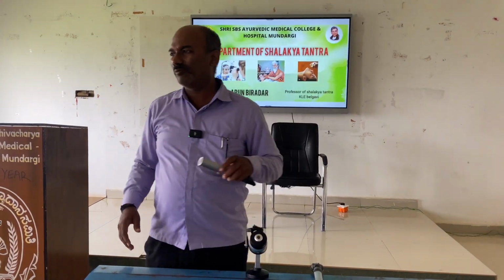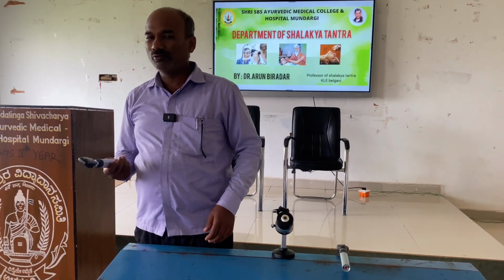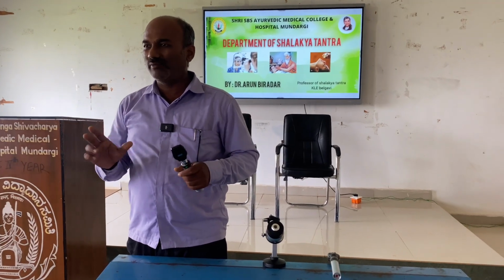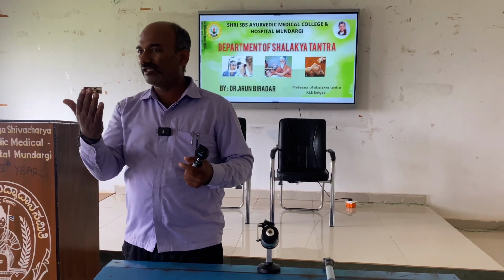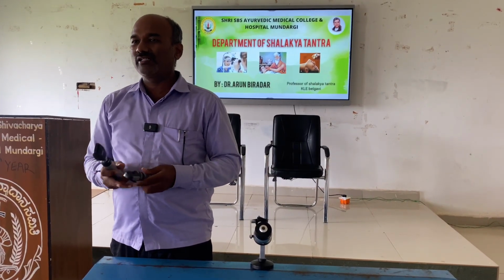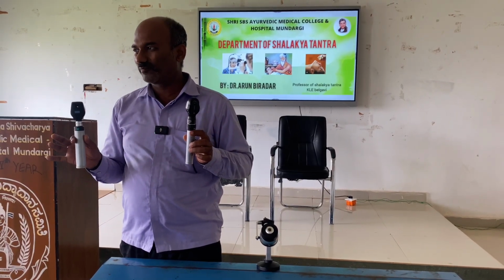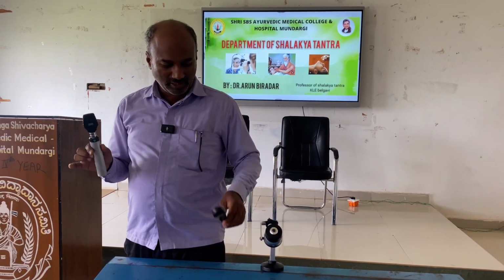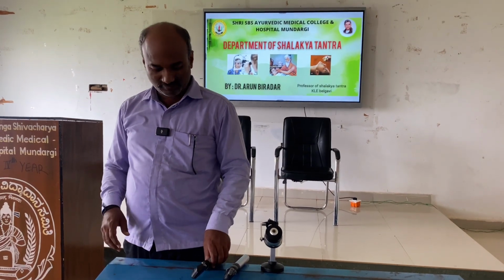You have various mobiles, iPhones, MI, Poco, all are smartphones only. But there is some difference in buttons, some side buttons, some operate with face recognition, right? Similarly here, all manufacturers manufacture their ophthalmoscopes with a bit of variation, right? And that variation makes the price difference, right?